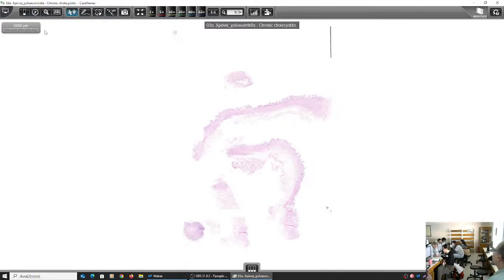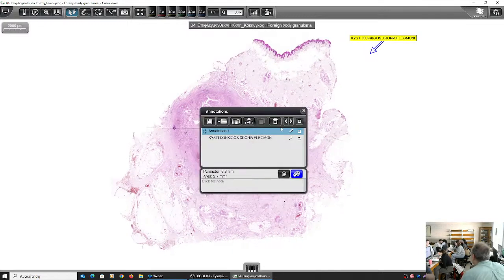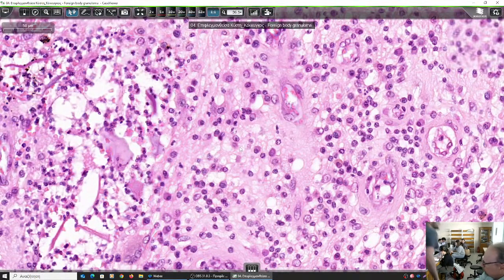Yes, please. The part about the granuloma, you said if it was a B cell or... If a granuloma is solely composed of B lymphocytes, it is not called a granuloma, it is called a lymphoid follicle. All right? And it can form a lymphoma, but it's not for today. So, no, sit down, folks.